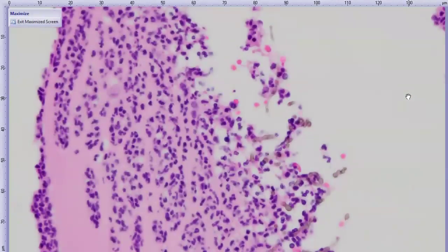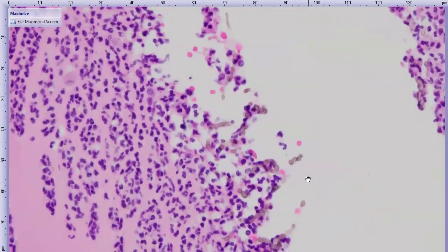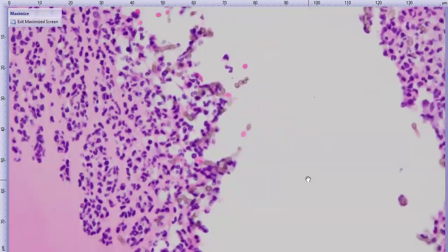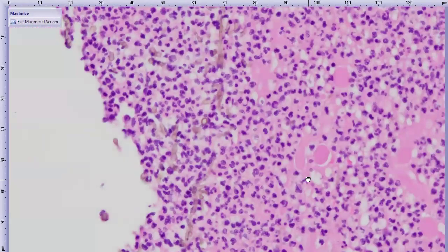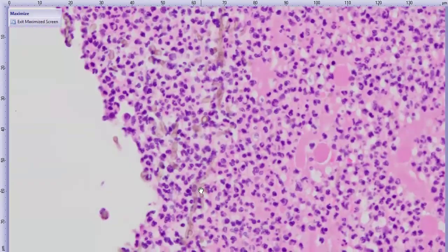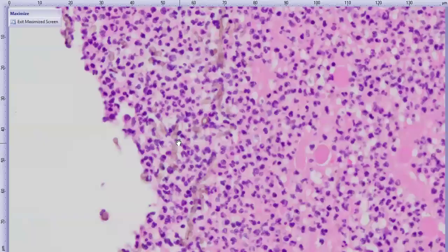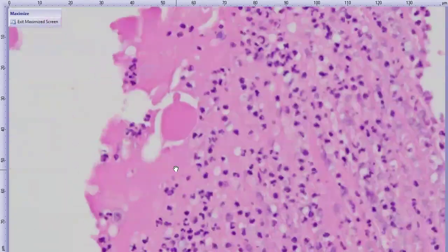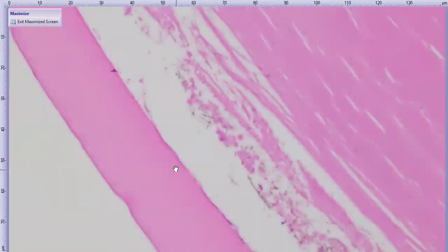If you get a little bit closer, we start to see that there's a few little friends here that have come along for the ride. And so we've got these brown pigmented hyphal structures. And so we have some nice fungal hyphae in the lens as well. If we scroll around, we can start to see that there's a fair number of them. They have kind of parallel walls. Some of them are a little bit bulbous. I'm going to follow this along because it gets even better. Go over here.